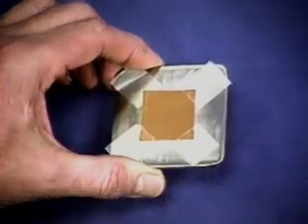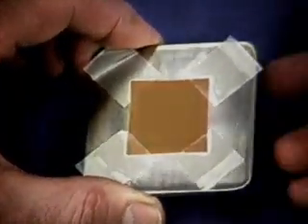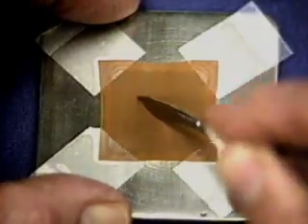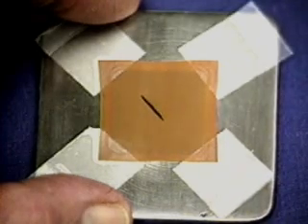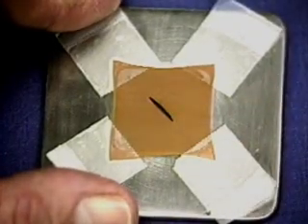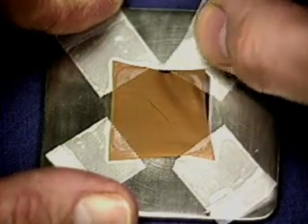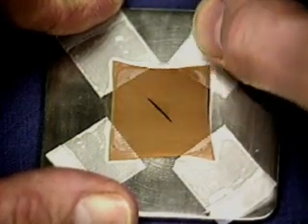The material we work on is a piece of regular surgical glove rubber stretched out under very slight tension. Cut it with a knife, and you've got a wound to stitch. If it pops open like this, the rubber is stretched out too much. You'll need to slack it off a little, or you'll have more tension than you can deal with.